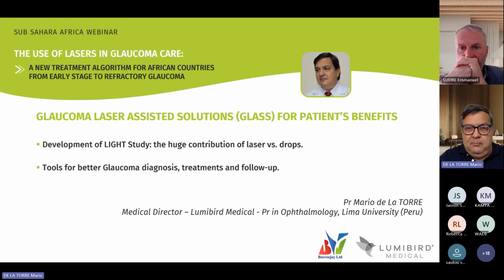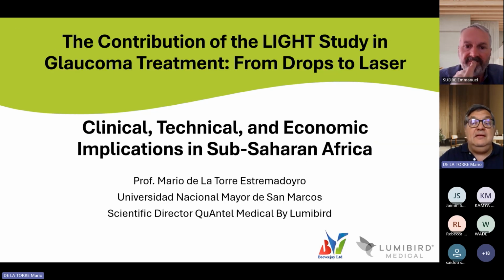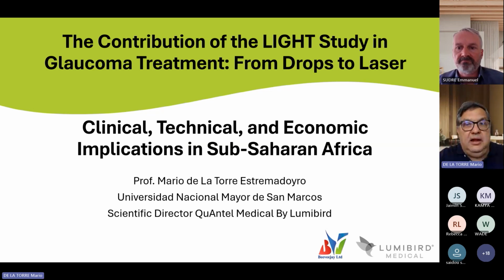What is the problem? The problem is SLT is not new. SLT has been around a long time, but it was bad luck that it went to the market just at the same moment that analogs of prostaglandins became available. We doctors have habits, and our habits sometimes are very hard to change. In this case, right now, because we have enough scientific evidence with the LiGHT study, we can talk about it.